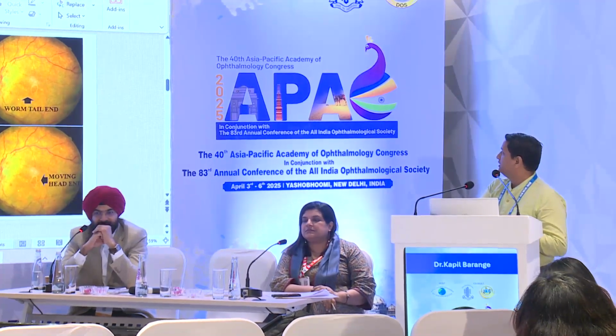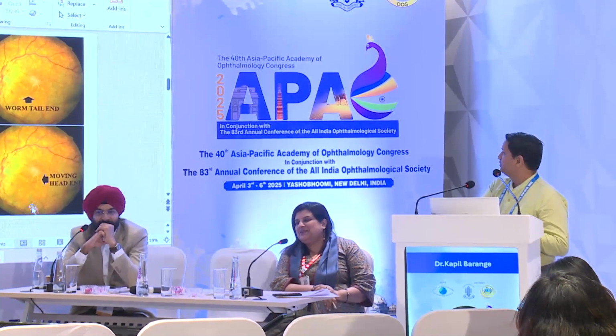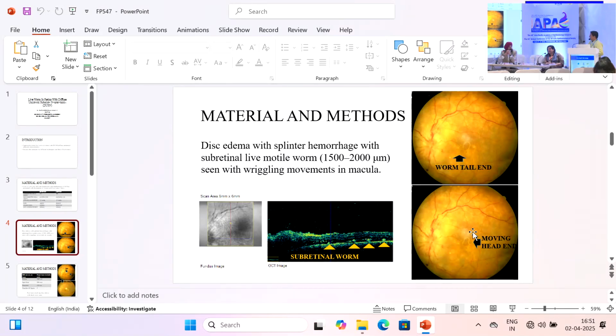So, very interesting. This is the head end actually. And these are usually not solitary, right? I mean, there will be many in the body. Yeah, the patient already had elephantiasis of the left leg.